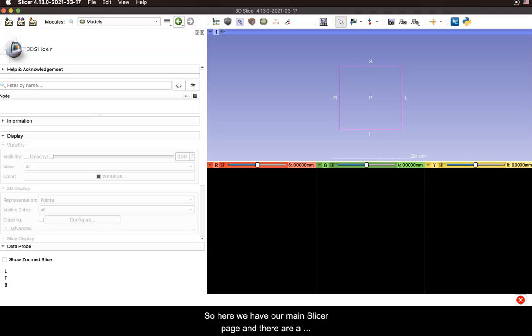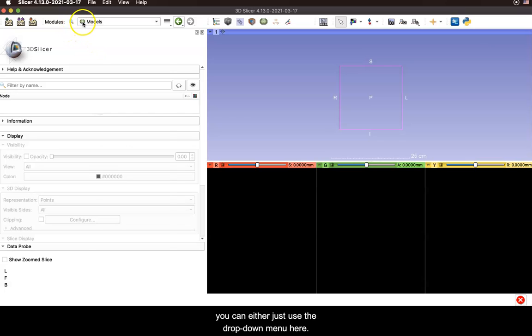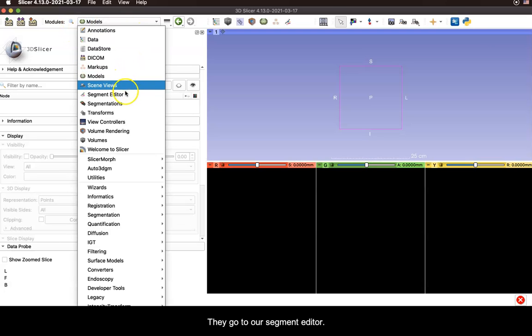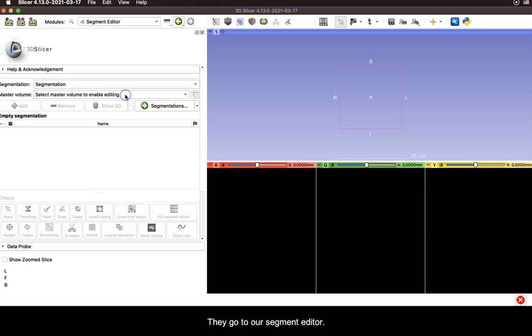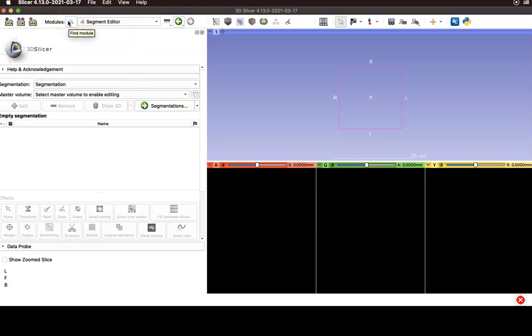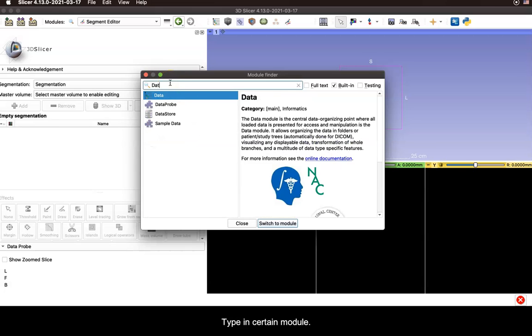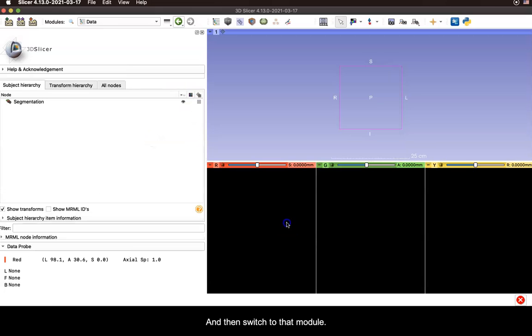So here we have our main Slicer page and there are a couple ways you can move between modules here. You can either just use the drop down menu here, say go to our segment editor, or you can use the search function and type in a certain module and then switch to that module.